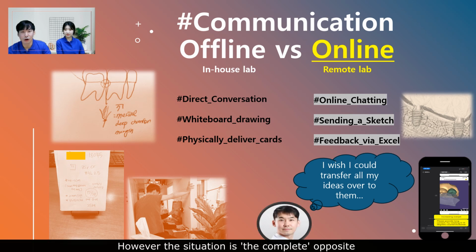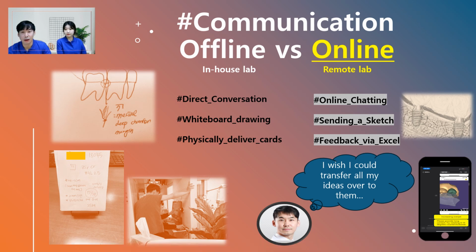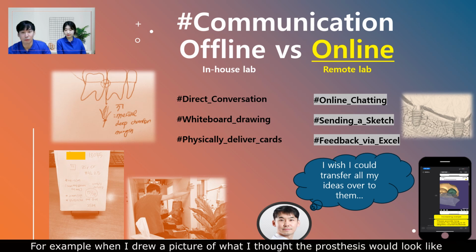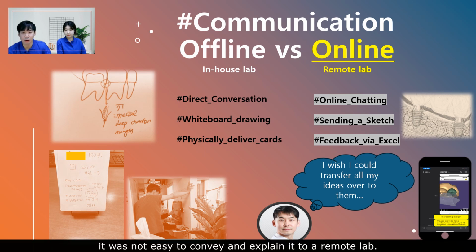However, the situation is the complete opposite when the dental work is outsourced. In the second question, we mentioned that we give an evaluation report on the process visually in Excel files. But the problem is that there is no open line of communication or sufficient exchange between the dentist and the technician. For example, when I drew a picture of what I thought the prosthesis would look like, it was not easy to convey and explain it to a remote lab.